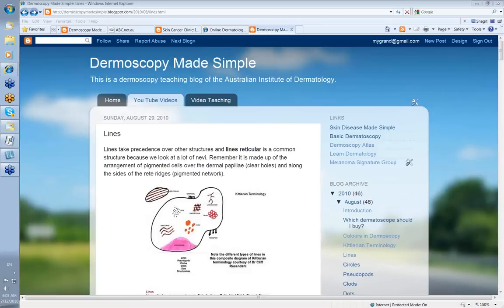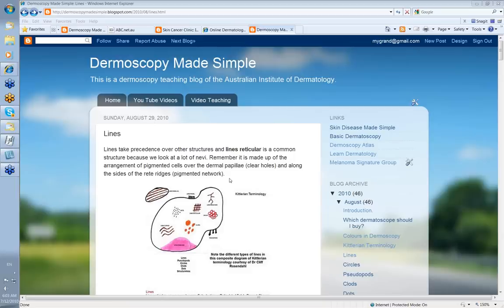Today we're going to look at lines, and particularly lines reticular. In the Kittlerian approach to diagnosis of dermoscopic lesions, lines take precedence over other structures, and lines reticular is a common structure because we look at a lot of nevi. Lines reticular is made up of the arrangement of pigmented cells over the dermal papillae, which gives you the clear holes because there's only a thin layer, and along the sides of the rete ridges where there's a second layer — that gives you the pigmented network.